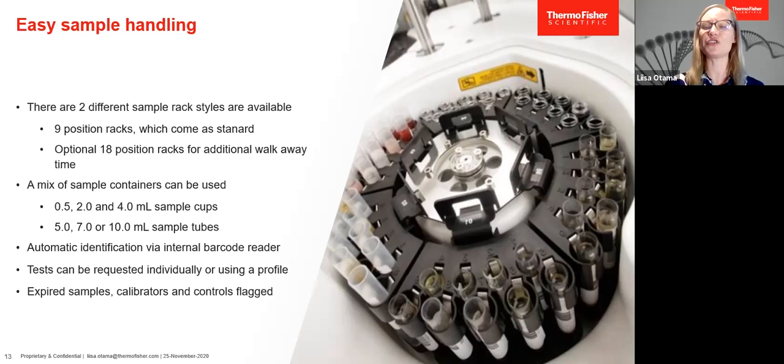There are a lot of great features in the software. For example, the instrument will flag if the samples are expired or if calibrators or controls are expired. So the instrument keeps you on track with what's going on.